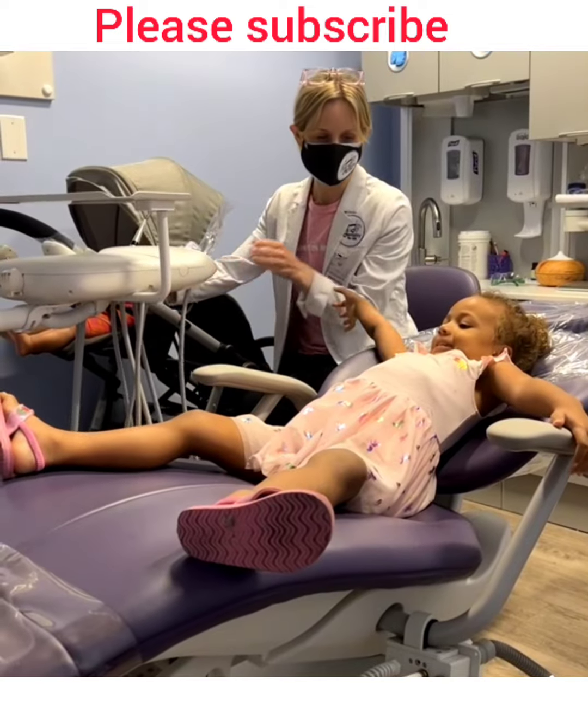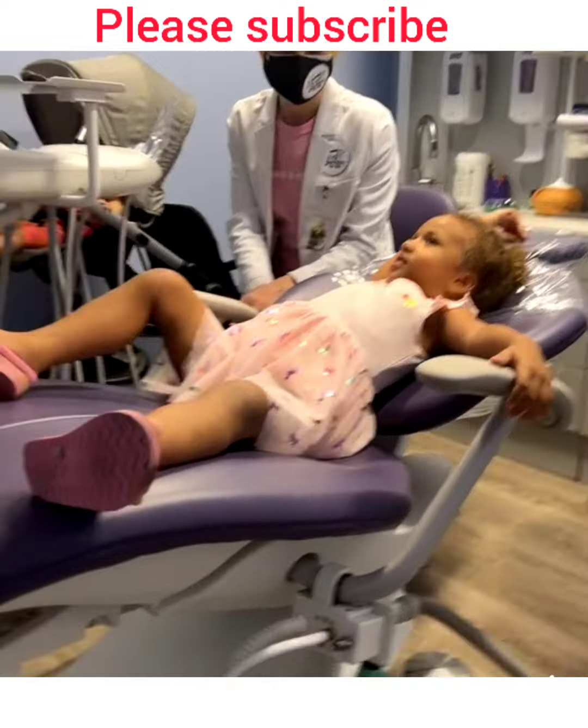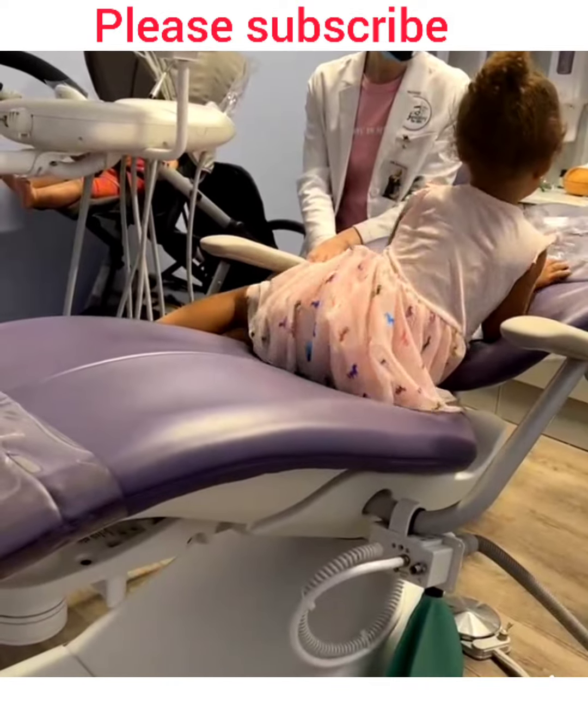Okay, I'm gonna see your teeth — we did this before. We count your teeth like with a little small mirror and brush them. You want to go right back? You want to lie down back?